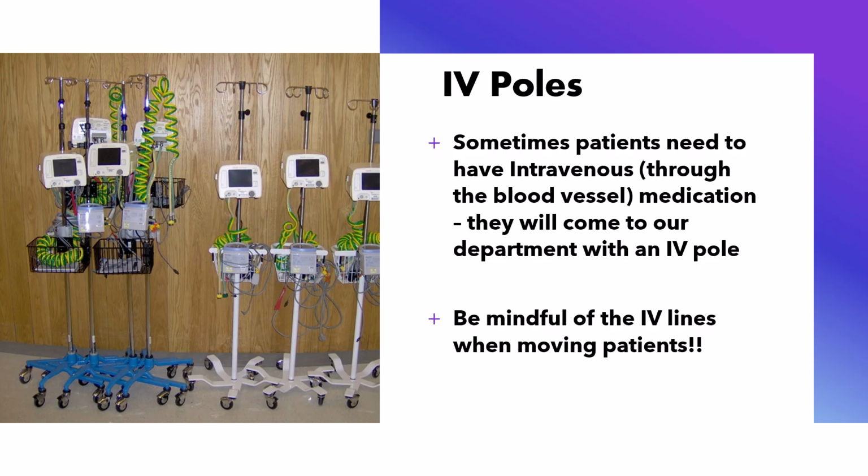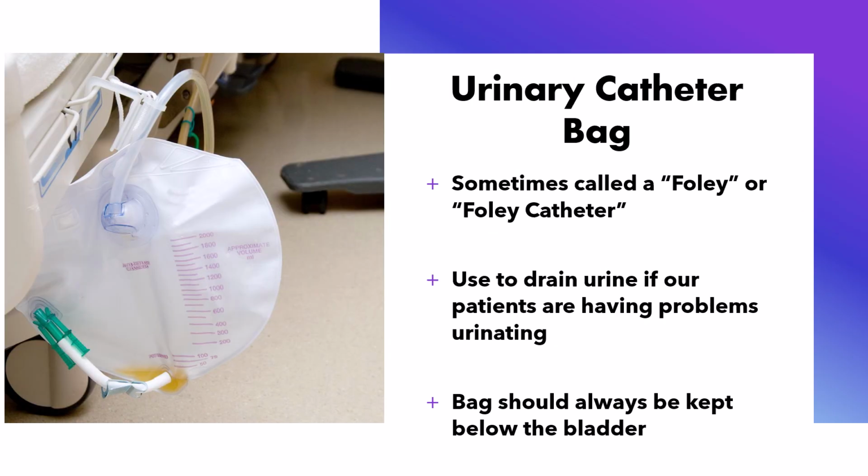IV poles, oh my gosh, they're just what they're said. They're for intravenous fluids or sometimes for blood, however you're delivering something to the patient. Most of the modern ones go through a machine that you can program to give a certain amount over a certain period of time. The thing I want you to do is be mindful of these IV lines when moving a patient. You want to be careful that you do not disconnect the IV from the patient.